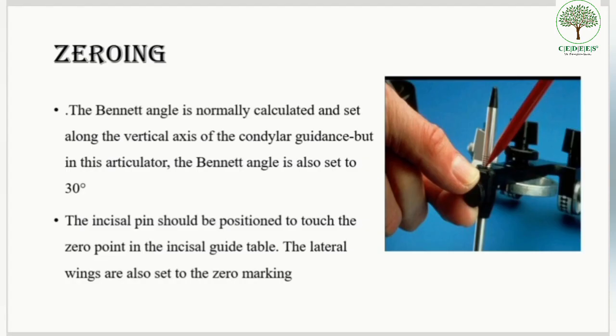Zeroing of the articulator means that before we start with the actual process of mounting, all values that can be manually changed in the articulator must be set at their base value — that is why it is called zeroing. The Bennett angle is normally calculated and set according to the vertical axis of the condylar guidance, but in the Hanau articulator, since it is semi-adjustable, we set the Bennett angle at 30 degrees.